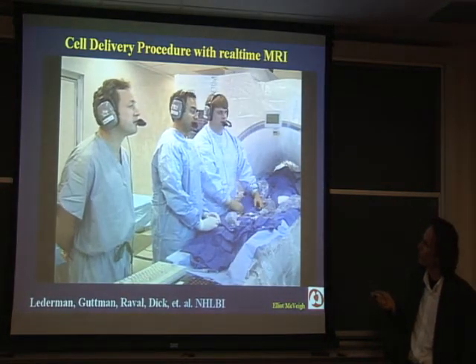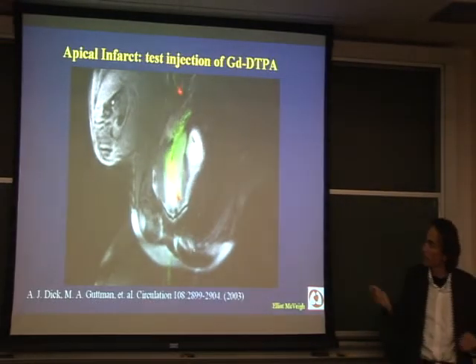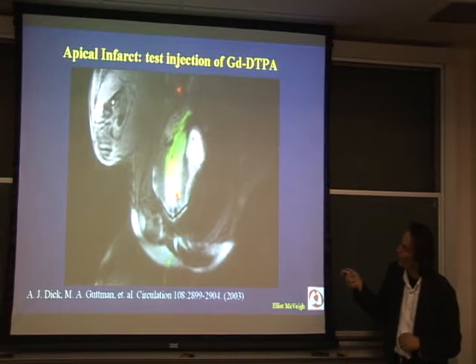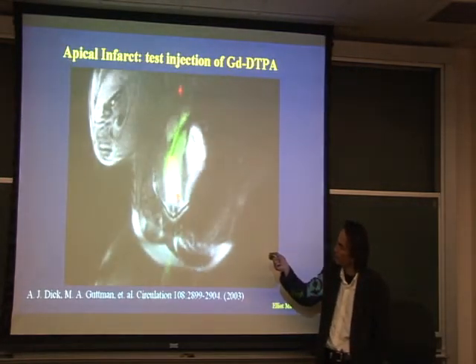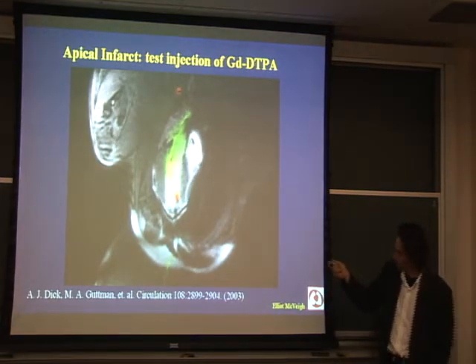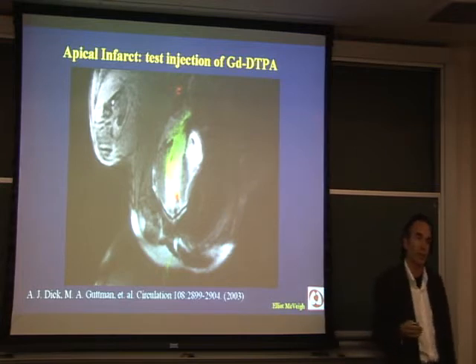And what they're doing is making injections into the heart around an infarct. So what they're looking at is something like this, where you have that catheter, the shaft of the catheter shown as a green line all the way down. That's the tip of the catheter. They've done a little test injection of gadolinium into the myocardium. You can see it quite brightly there. So they've got good purchase into the myocardium. There's an infarct here that they're trying to inject mesenchymal stem cells around.